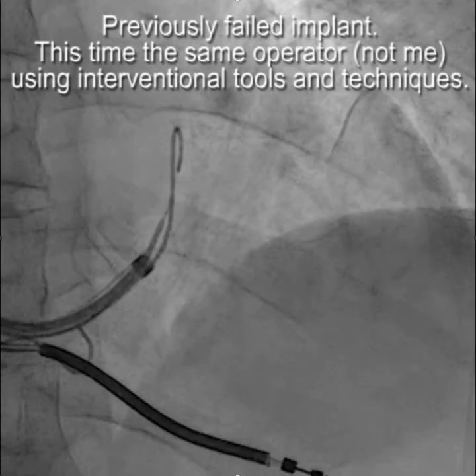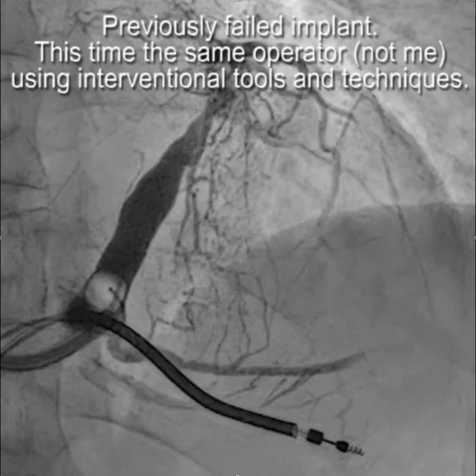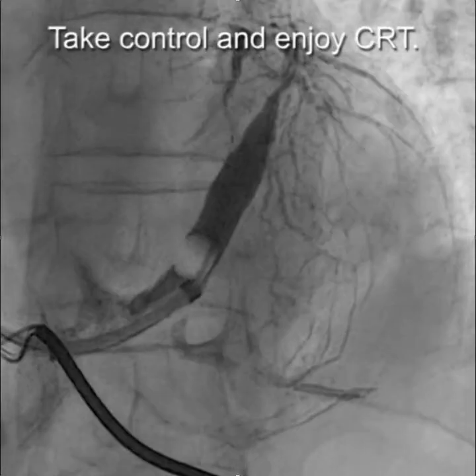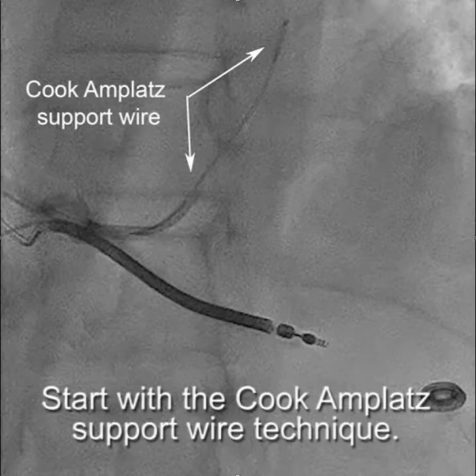This is a previously failed case. This time the same operator, not me, is using interventional tools and techniques. This is the initial venogram, and we start with the Cook Amplatz support wire technique.